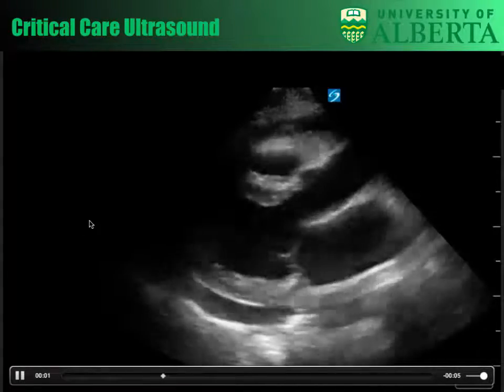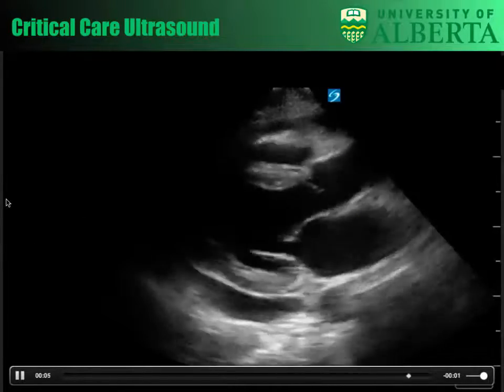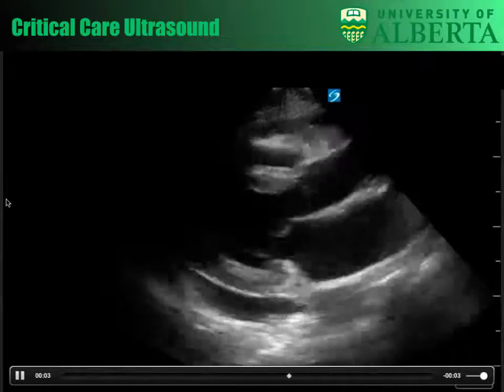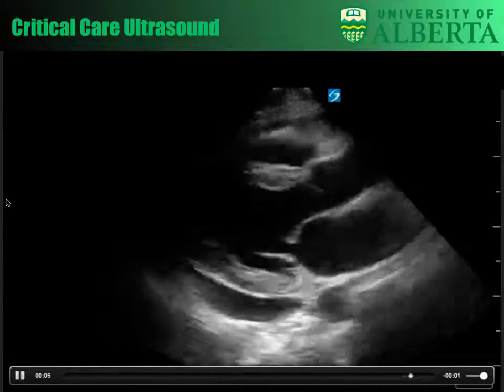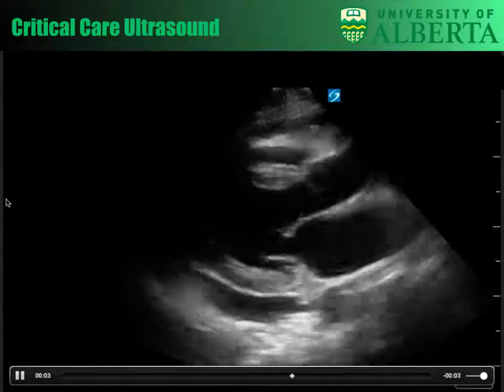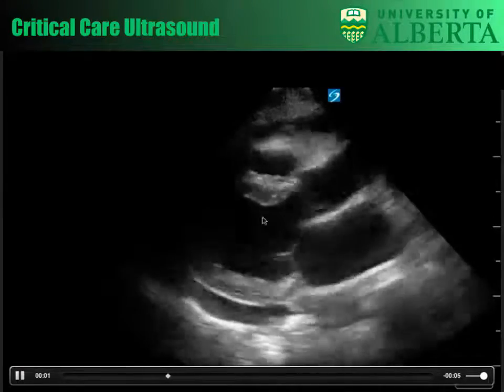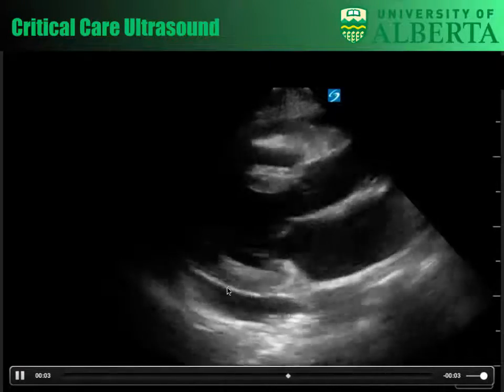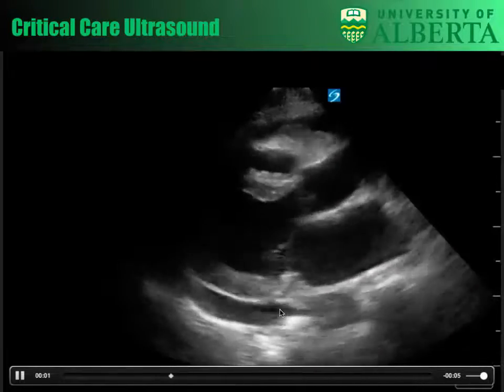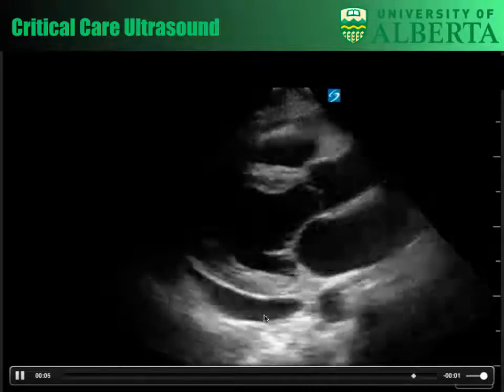So this is a nice image. Now, what do we see? What is most striking in this image here? Yeah, we see an effusion, right? I'll point along with you. It's the green one. It's seen anteriorly as well, right? Excellent. So there are 2 important things there. We're seeing separation of the inferior wall. We're seeing it go anterior to the descending thoracic aorta, and we're seeing it in the anterior space as well.